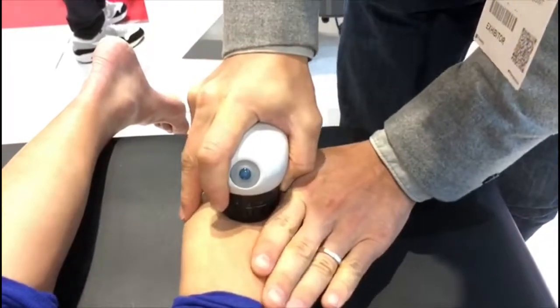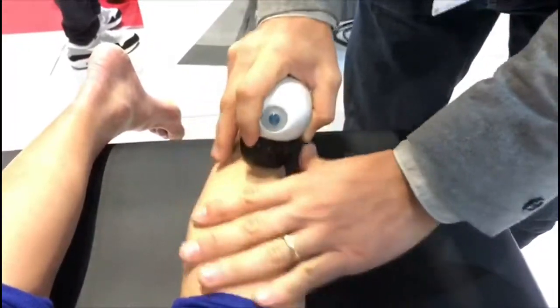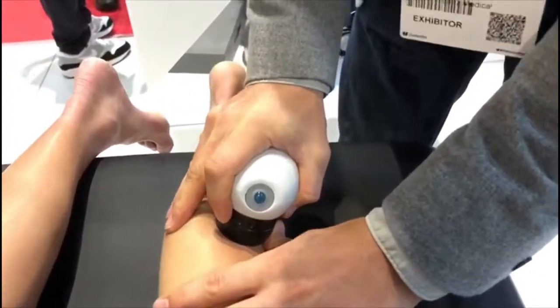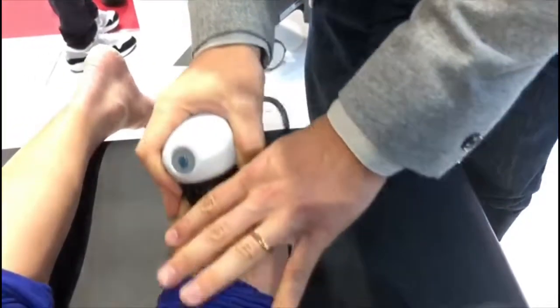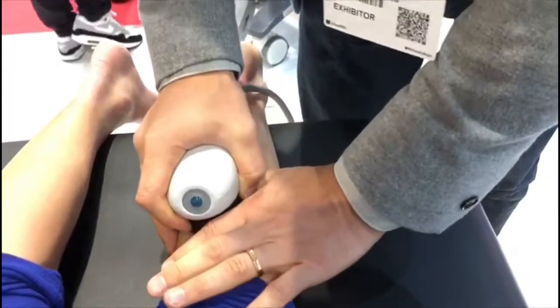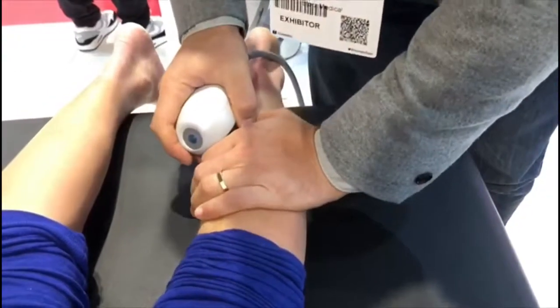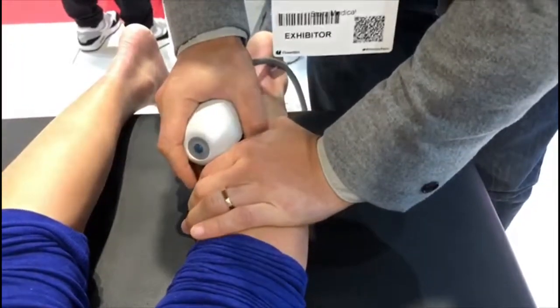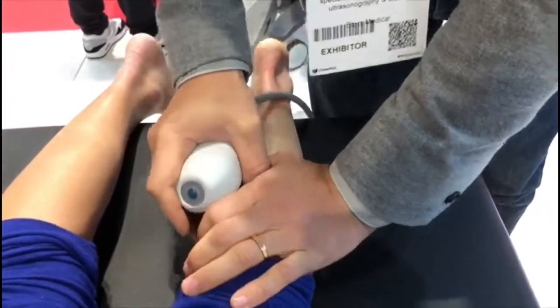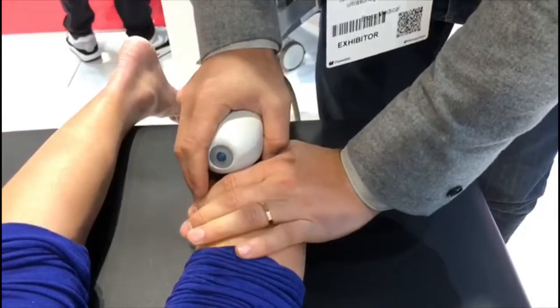But there's another interesting fact as well, which is that I'm working at a frequency — at the moment 28 hertz. When you go above around 20 hertz, then you talk a lot to a mechanism called the gate control system, which actually gives a more generalized pain reduction in the body.